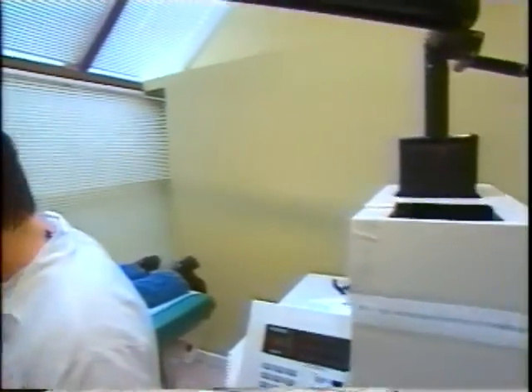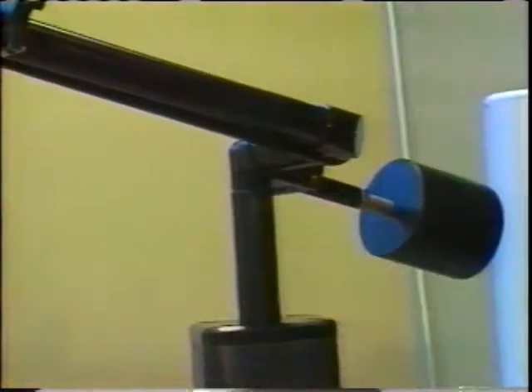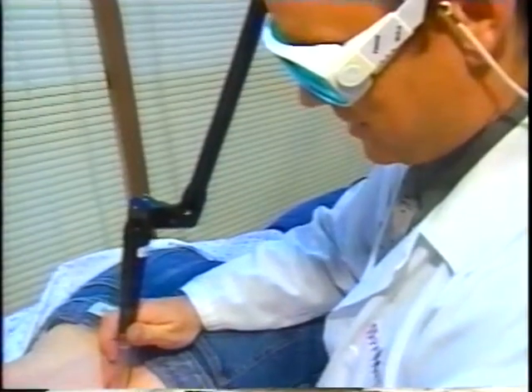And often it fades about 20 to 25% per treatment. So what I tell people is, number one, it takes a lot longer to get a tattoo off than it does to get it on. Right. Number two, it costs a lot more to get it off than get it on. And that will take multiple sessions. So this will probably take between 3 and 8 treatments to remove. The cost depends on the size of the actual tattoo and the colors, but generally can run anywhere from $150 to $500 a treatment. Now, does this work on all parts of the body?